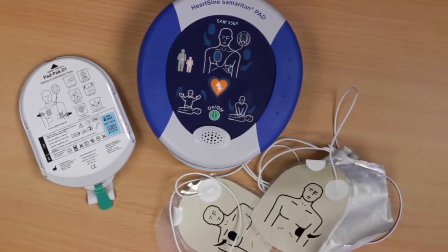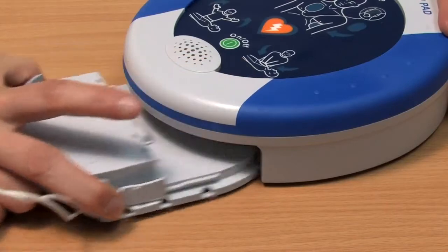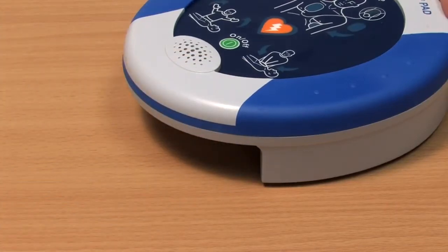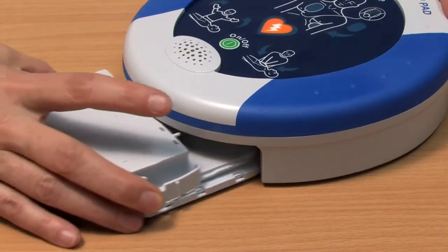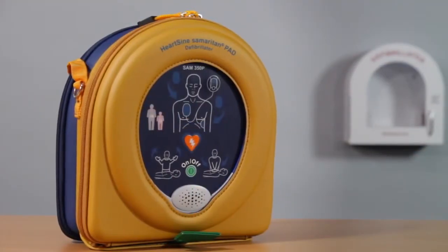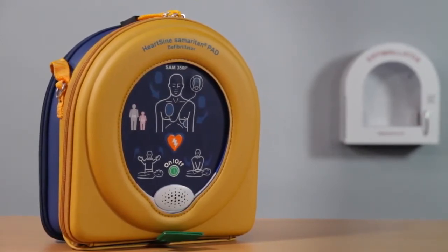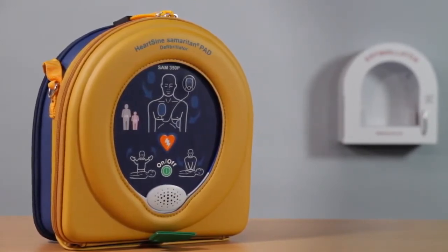After you use the PAD, you will need to replace the pad pack. To remove the pad pack, squeeze the tabs on the sides and slide it out of the PAD. Once a new pad pack is installed, place the Samaritan PAD back in the case provided. Follow your local battery disposal guidelines for disposal of the pad pack.